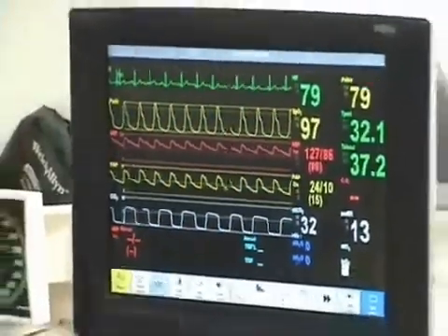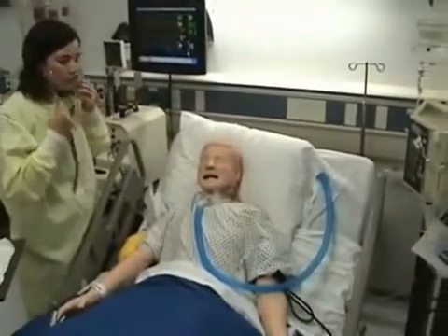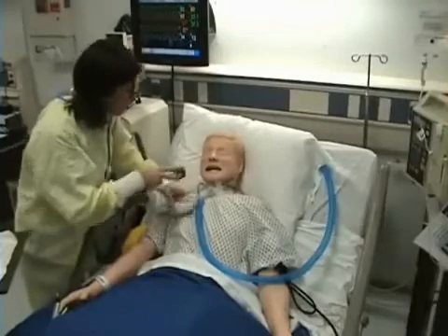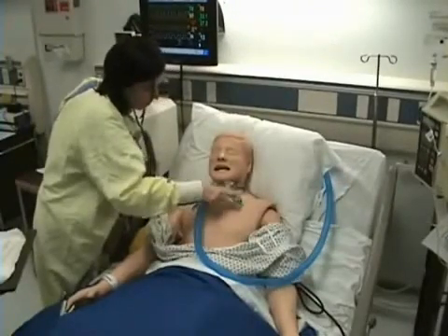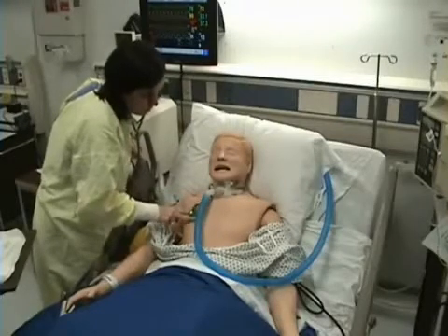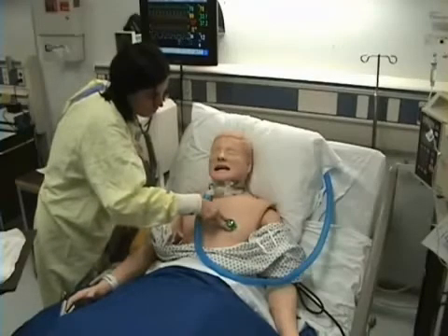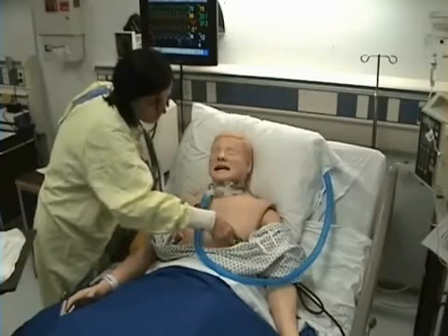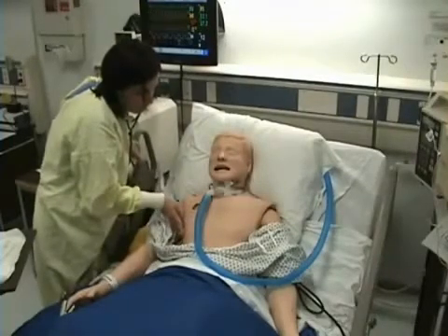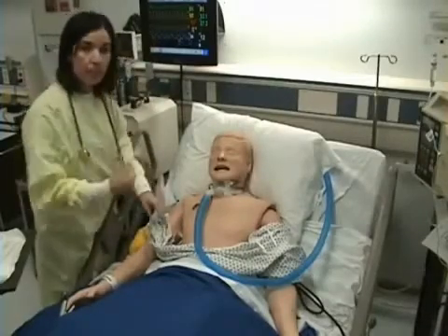I want to listen to his lungs anteriorly and posteriorly. We always listen under clothing. I would turn my patient and listen posteriorly.